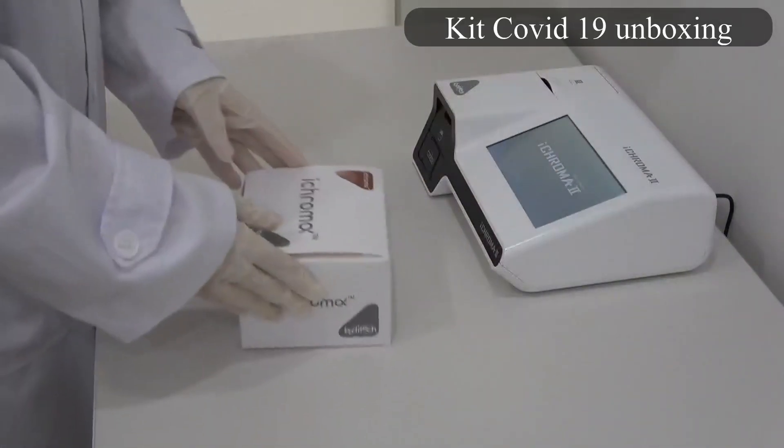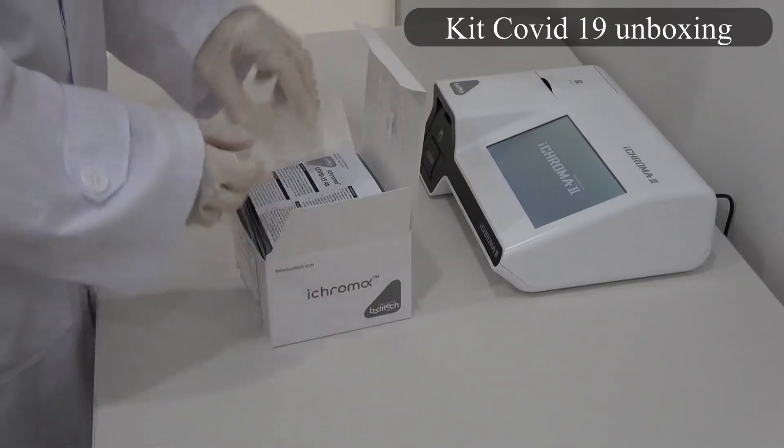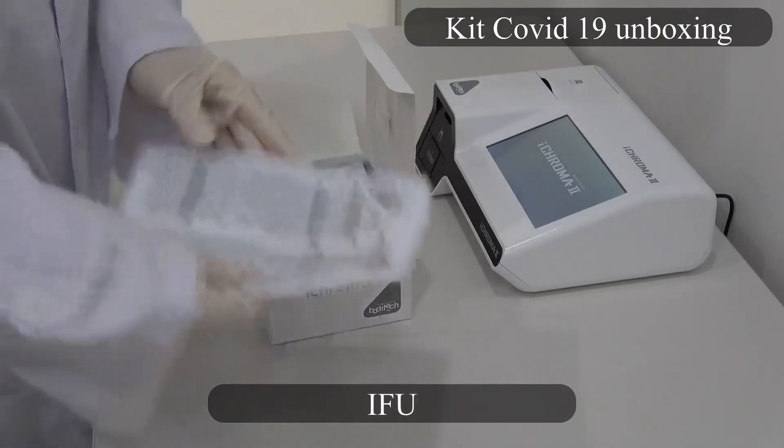Kit COVID-19 unboxing. Instructions for use.